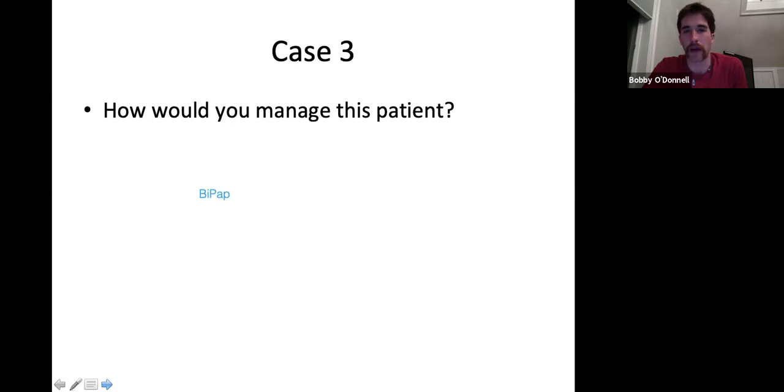They'll say they're on BiPAP at 10/5. That means their IPAP is 10, their EPAP is 5. So on our LTV1200, what that means, just refreshing it again, is you're setting the PEEP to 5 and the pressure support to 5, because the IPAP is the pressure support plus the PEEP. So something to keep in mind.